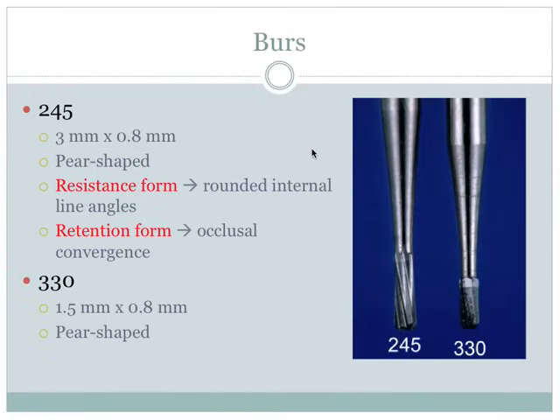So let's talk about some instruments and materials we commonly use in operative dentistry. Burrs come as carbide burrs, which are made of tungsten and carbon. They also come in diamonds, available in similar shapes and sizes, but different. In one way, they're more expensive, but they also provide a rougher surface that abrades rather than cuts.